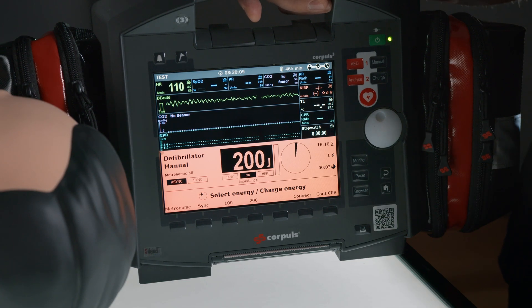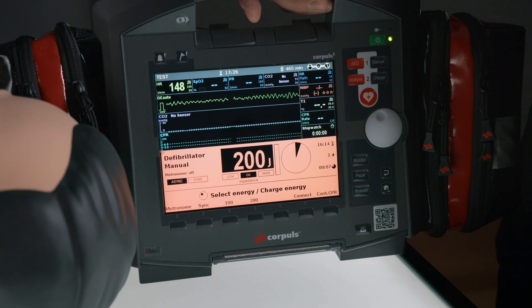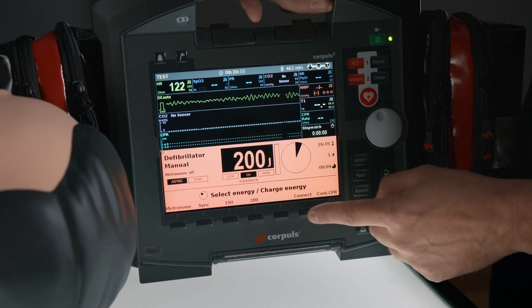If a Corpulse 3 and a Corpulse CPR are both in use, we can connect the two devices using the soft key Connect.